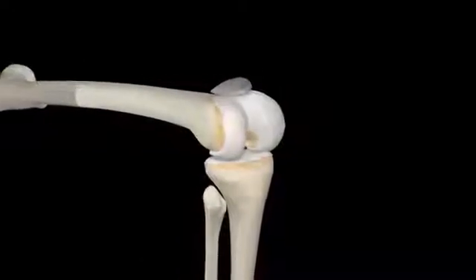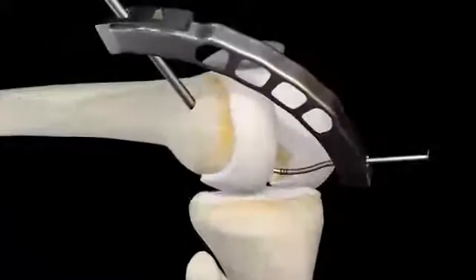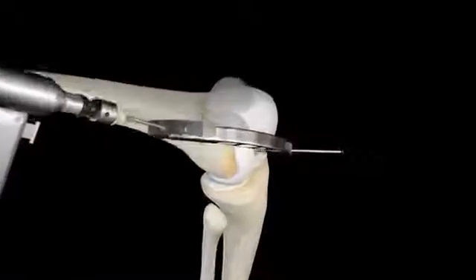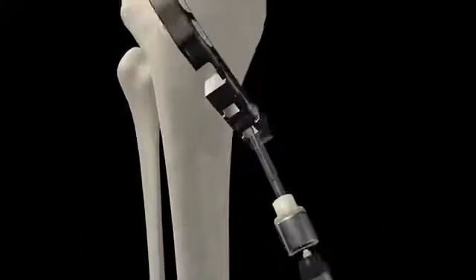Then, the surgeon will use a device called a retro flip cutter to create a tunnel through the femur and into the knee joint. The surgeon will also create a tunnel through the tibia and into the knee joint from below. These two tunnels become the source of the anchor points for the ACL graft.